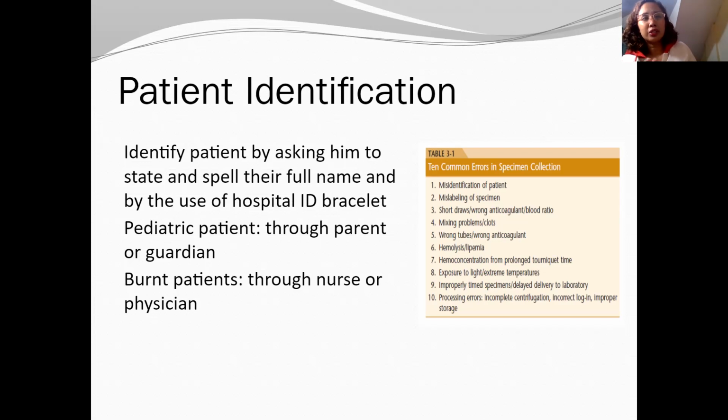So we have to ask the nurses and physician. Guys, a good example: when the patient was admitted and you're the one who's going to extract, always drop by the nurse station to inform them that you're going to extract blood from a certain patient, because sometimes they will give you a heads up of the precautionary measures.